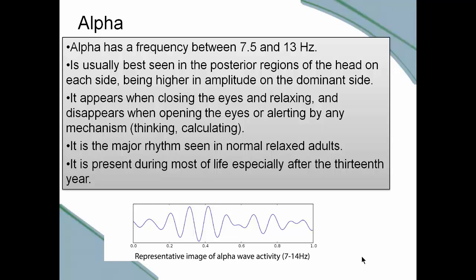And it is in fact the major rhythm seen in normal relaxed adults. With your Muse, now for our purposes and with this class, we're going to use Mind Monitor, and the Mind Monitor gives us ways in which we can look at all the frequency responses. And this is something that I do hope that all of you just play with and have fun with.